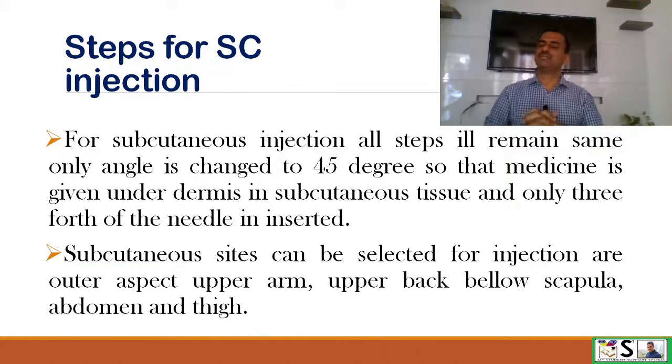The subcutaneous site can be selected for injection as per choice of the client and as per the amount of the medication. Upper aspect of the upper arm, outer aspect, and upper back below the scapula, abdomen and thigh. These are the sites for subcutaneous injection.